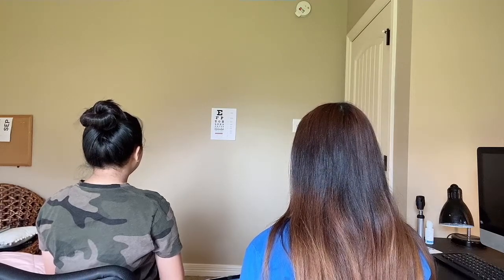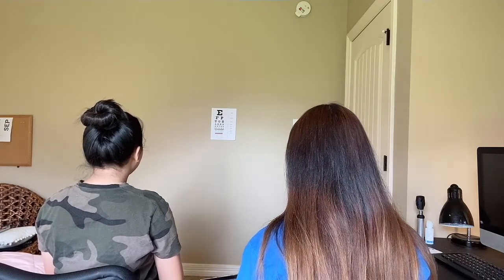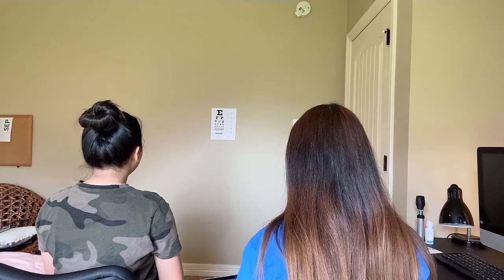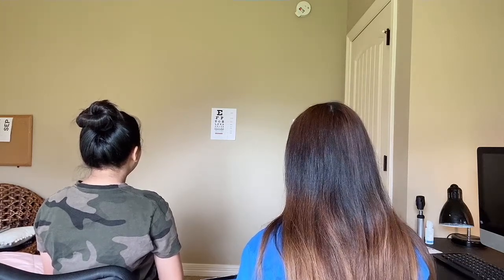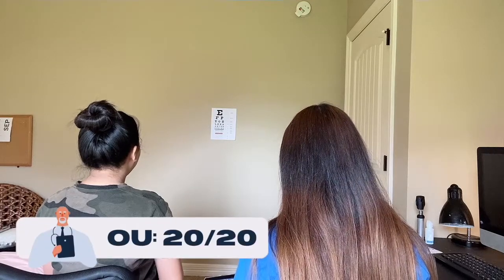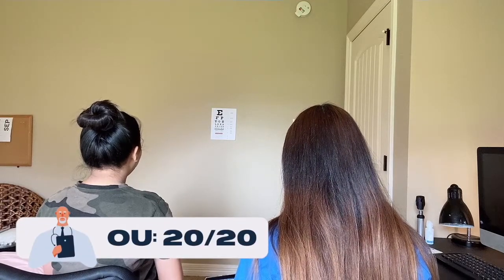P, E, C, F, D, E, D, F, C, Z, P, F, E, L, O, P, Z, D, D, E, F, P, O, T, E, C, L, E, F, O, D, F, C, T.